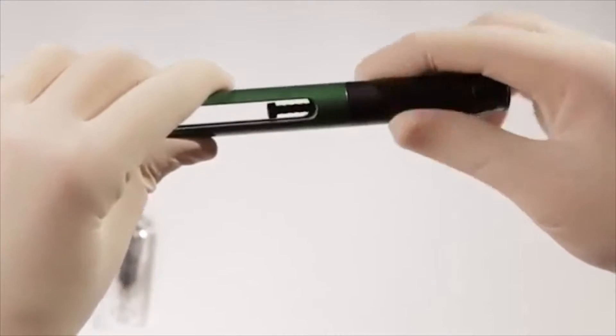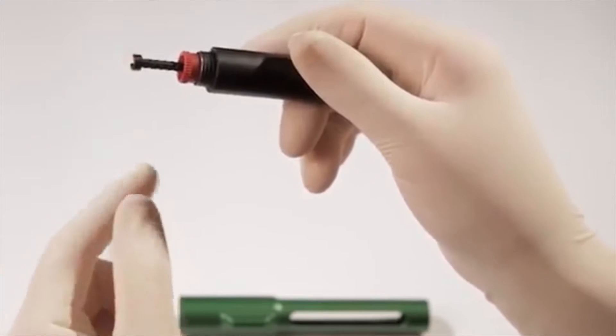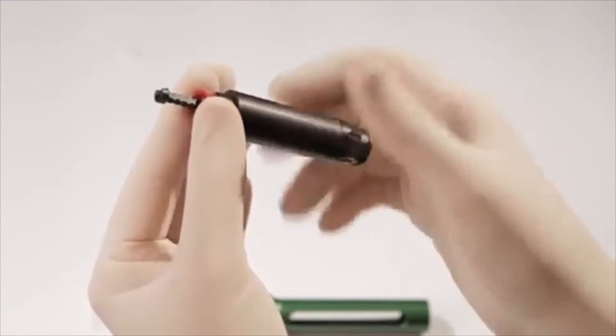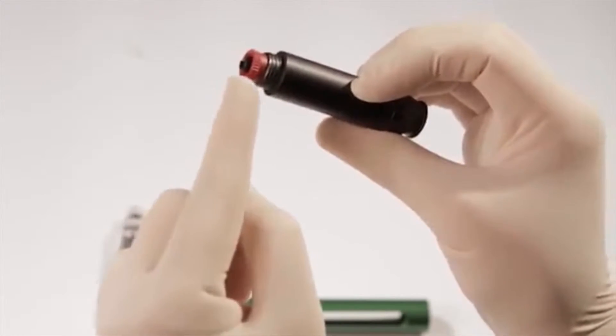Prior to loading each new 3-milliliter cartridge into the pen, unscrew the body from the chamber and check to see if the internal piston is fully retracted. If it's not fully retracted, grip the red reset mechanism with your thumb and forefinger and rotate the pen counter-clockwise until the piston rod is fully retracted and stops.